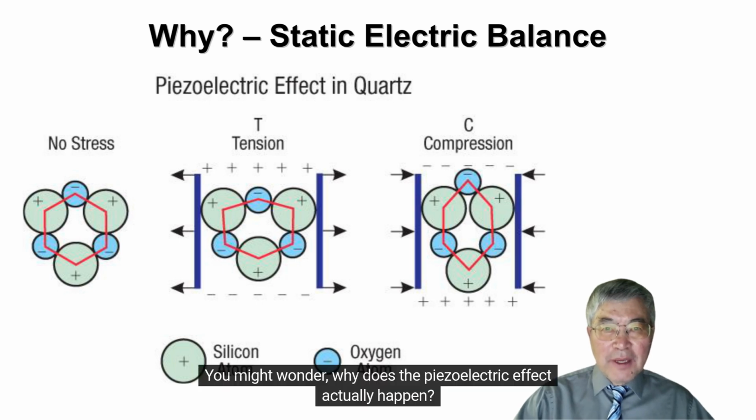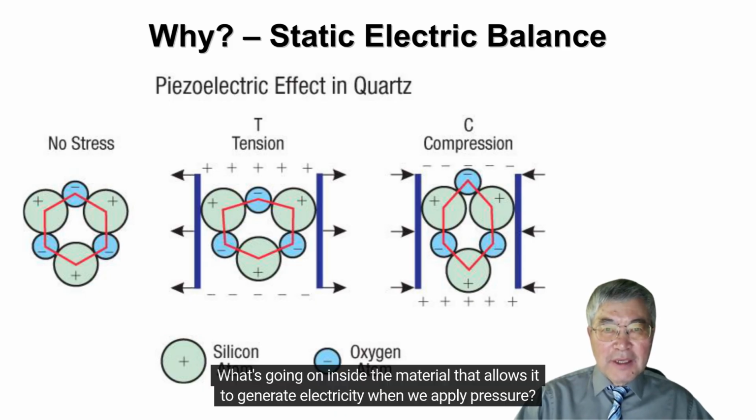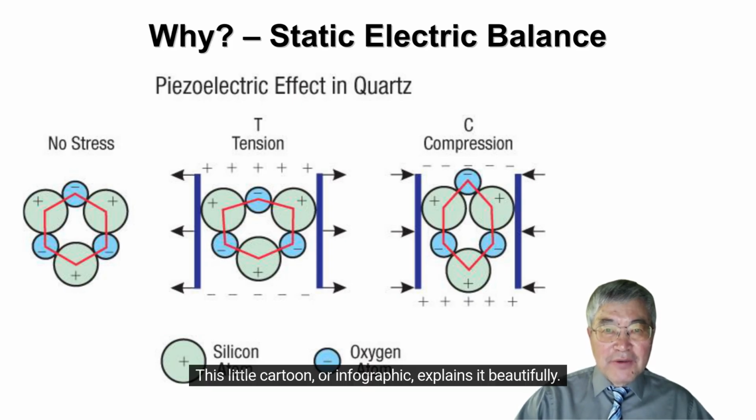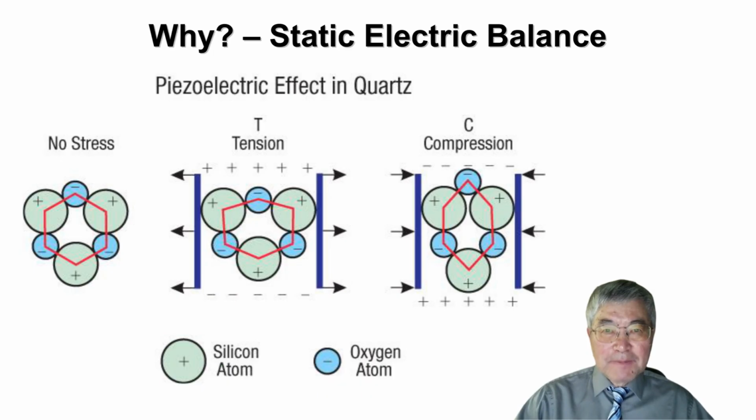You might wonder, why does the piezoelectric effect actually happen? What's going on inside the material that allows it to generate electricity when we apply pressure? This little cartoon or infographic explains it beautifully.